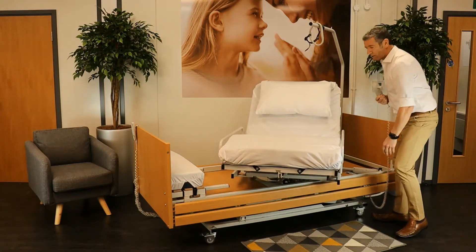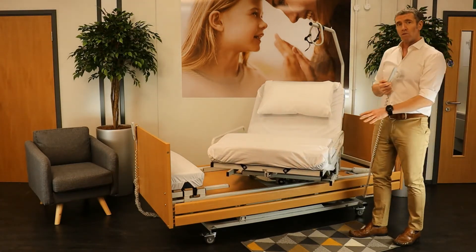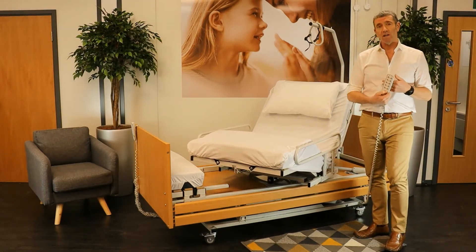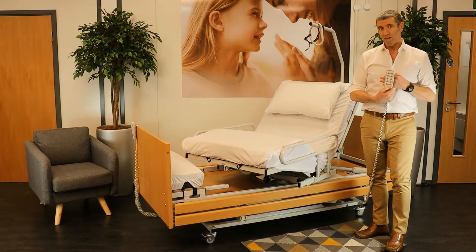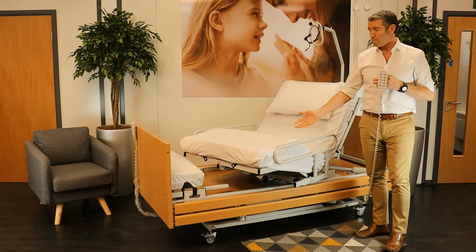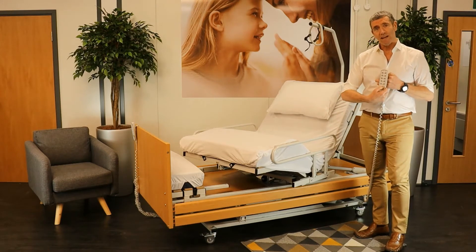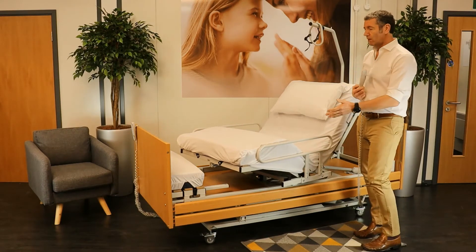You can see these are the side rails. This is very smooth and a very, very quiet operation. At any point while the bed is turning that I feel uncomfortable, if I was in the bed, I could just let go and the bed will stop. By then pressing in again, the bed will continue into its position.